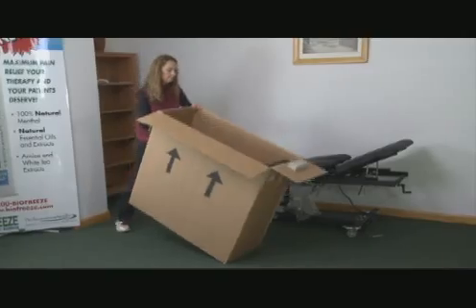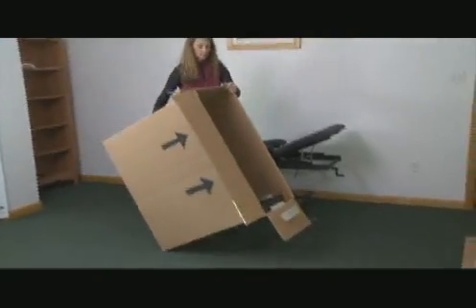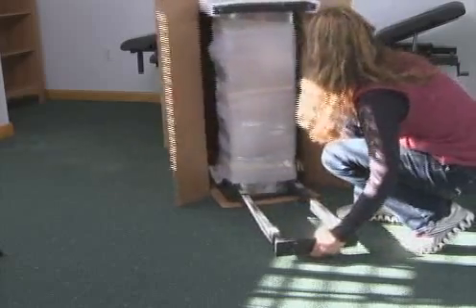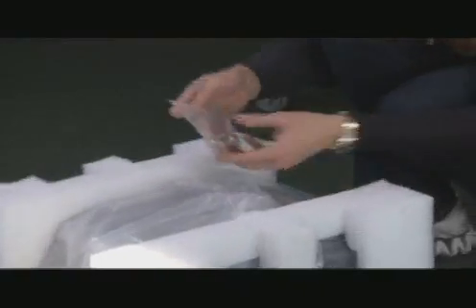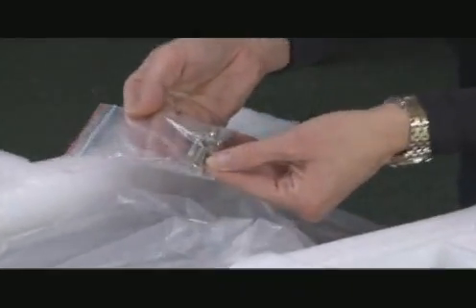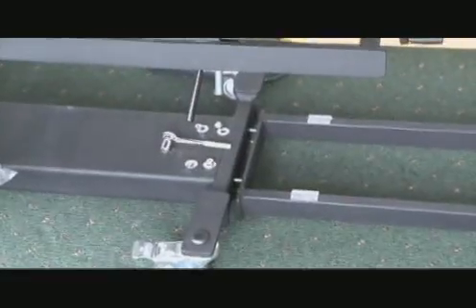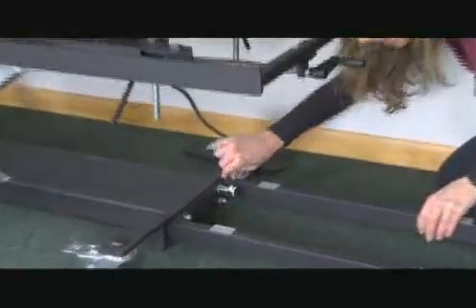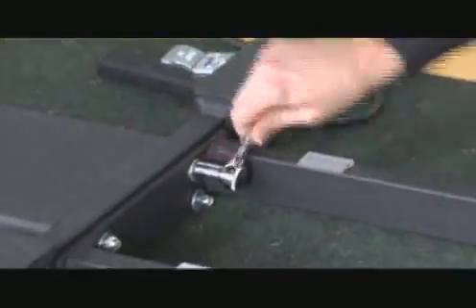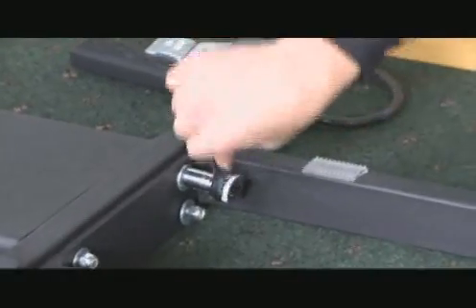Carefully tip the box on its side as shown and slide the motor mount base out from the box. Locate the decompression drive mounting bolts and unwrap them. Position the motor mount base tower as shown, sliding it into position on the table base mounting studs. Using a half inch socket, tighten all four bolts securely as shown.